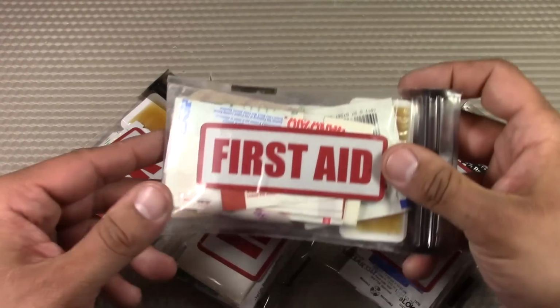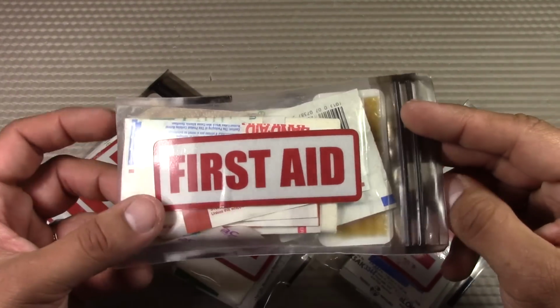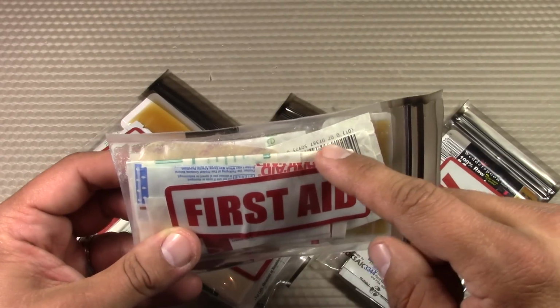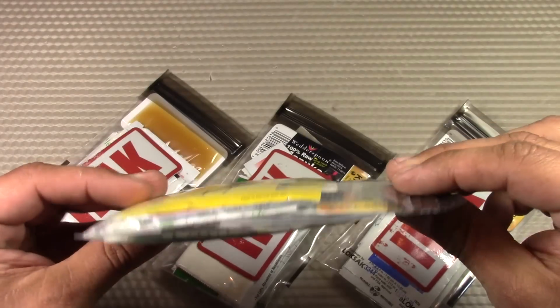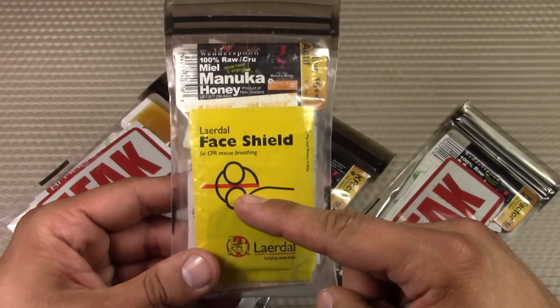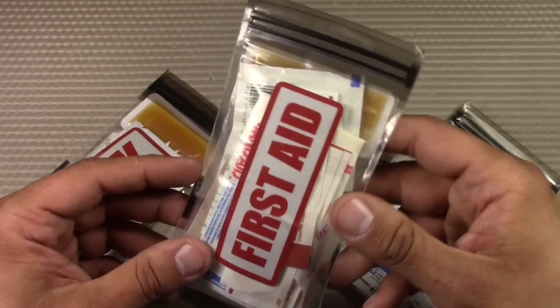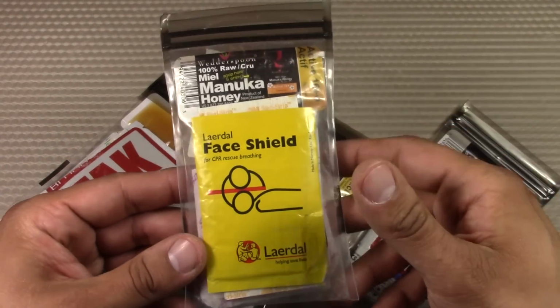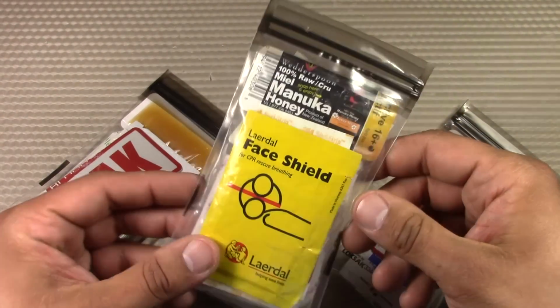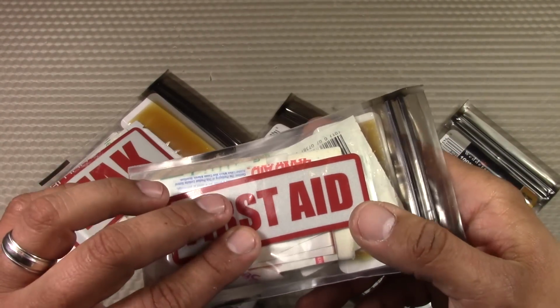And this particular version of the Mini Medi features all the latest and greatest gear that I've been including in my first aid kits with regard to the locksack bag, some of the upgrades to the medical items in here, like those modern wound dressings. I used to have a label on the back side of the Mini Medi kit that had an itemized list of everything that was included in this particular kit, although I found that it quickly became obsolete because I'm always changing out the different items that are in here. So I stopped including it, although I'll probably reintegrate it at a later time.